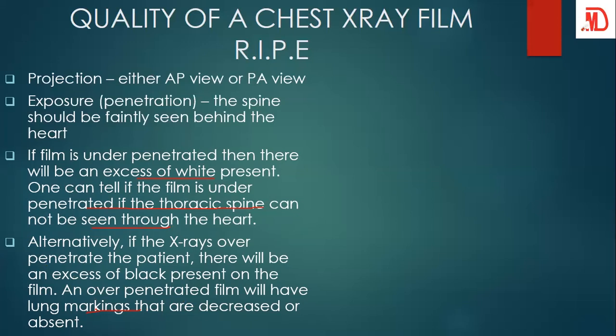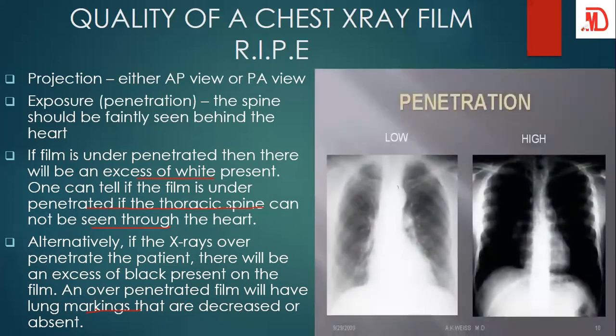Good. So this is what I mean. We have the low penetration and then the high penetration. Look at the low penetration: we cannot really see the spinal cord or the spine. That's what we use to know if indeed this is under-exposed or under-penetrated.